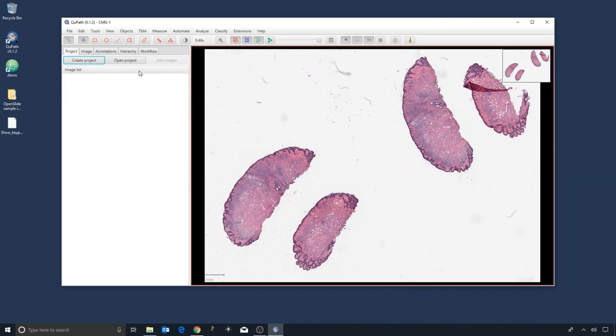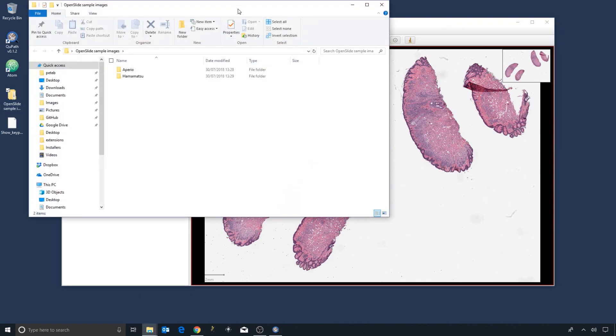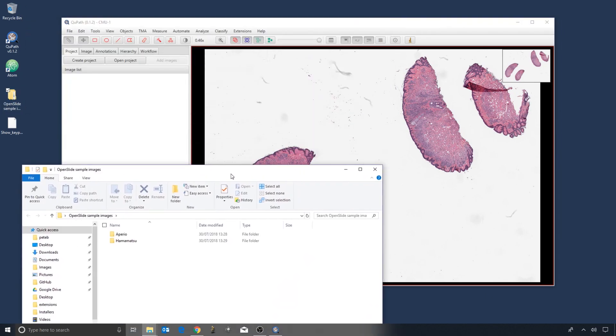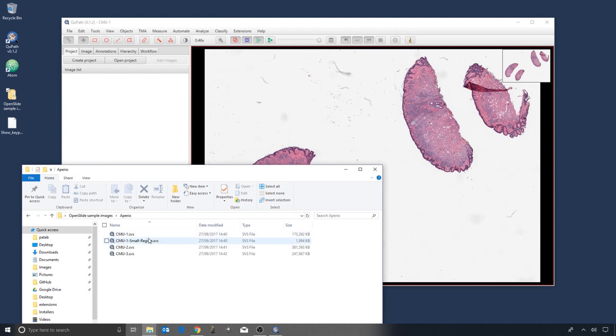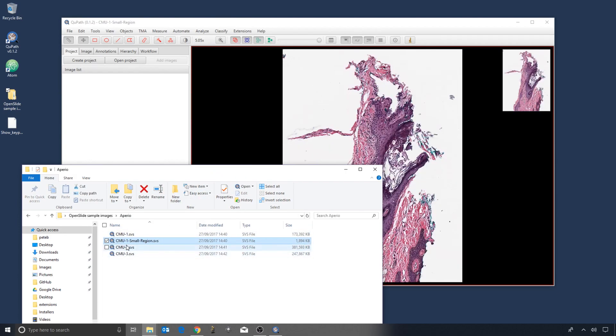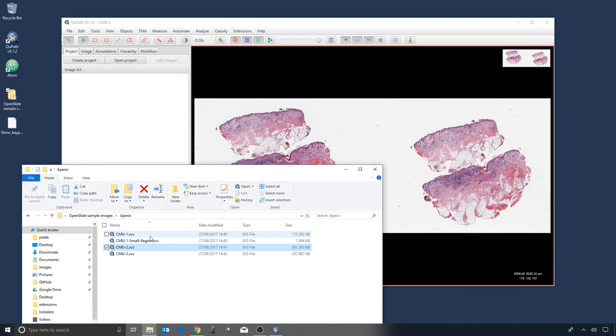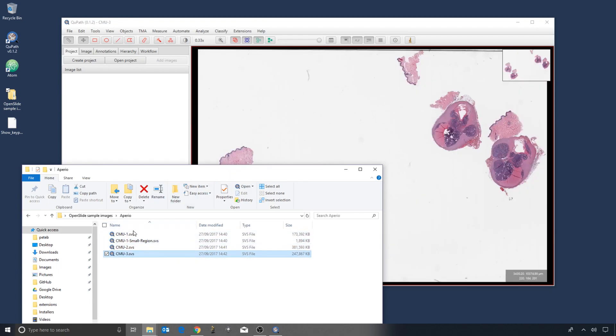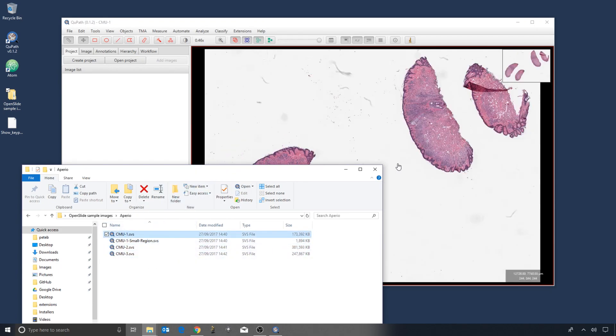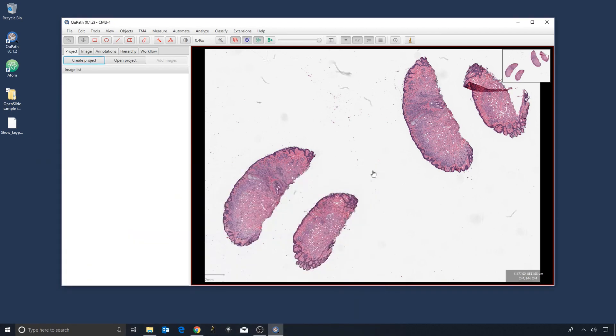...way is to find my images within Windows Explorer and just drag them on top of QPath. In general, you can open things in QPath that way. Similarly, as we're going to look in a bit more detail through the software, I tend to use a lot of shortcut keys.